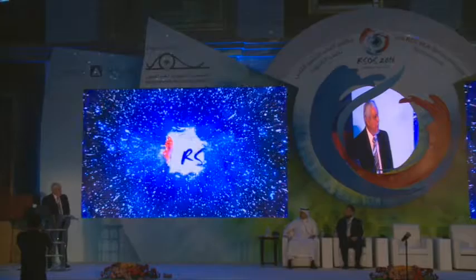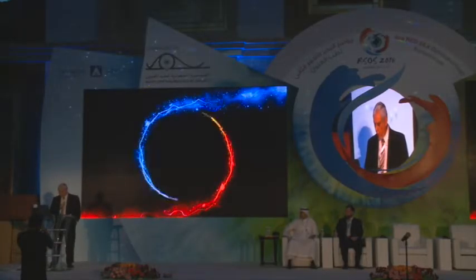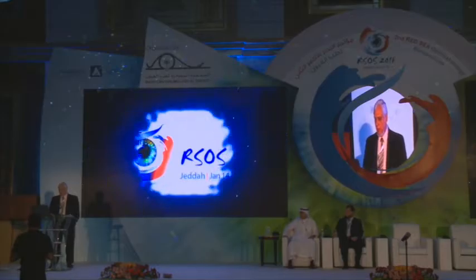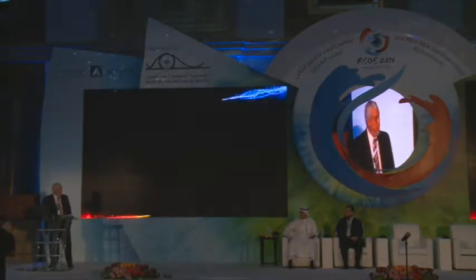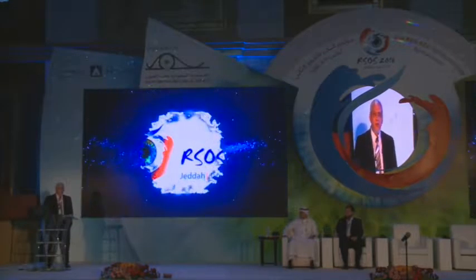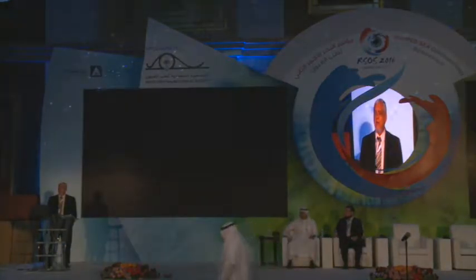I am a little controversial with my good friend Sinjab, because in my opinion, topography is beyond Placido. We have topography of the anterior and posterior surface, as we have topography of any land.